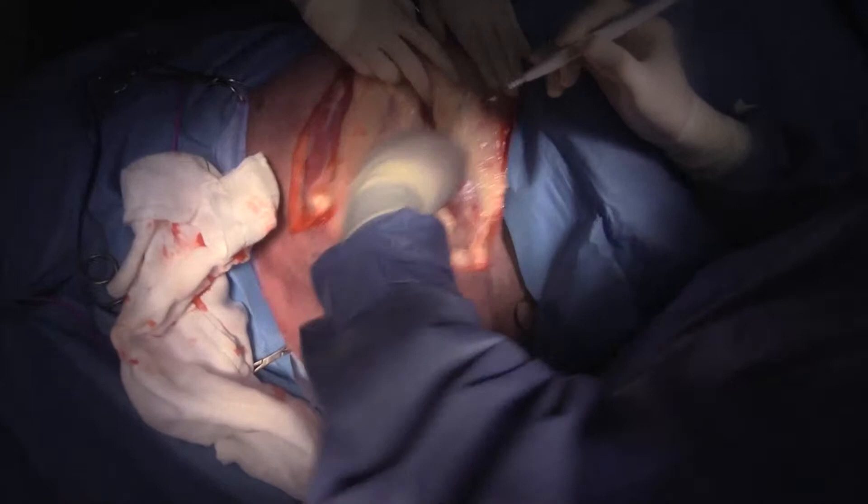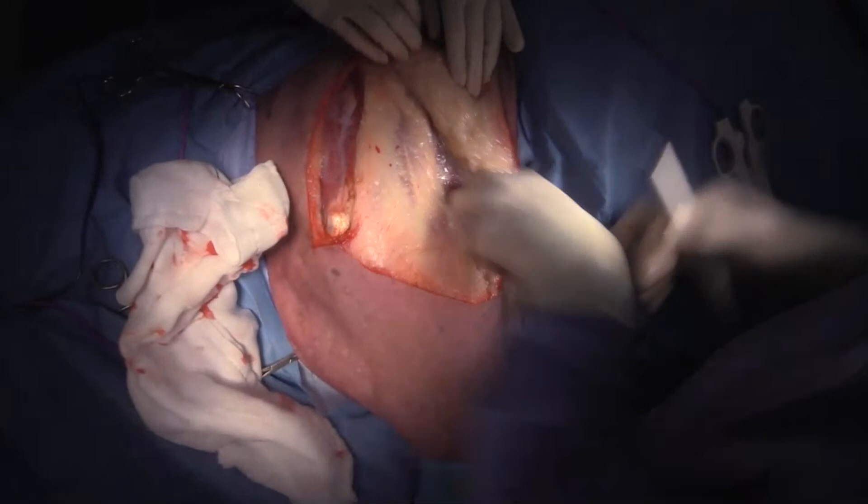Okay, so that's underneath latissimus dorsi right there. There's actually more of it up there — can you retract that forward up here?